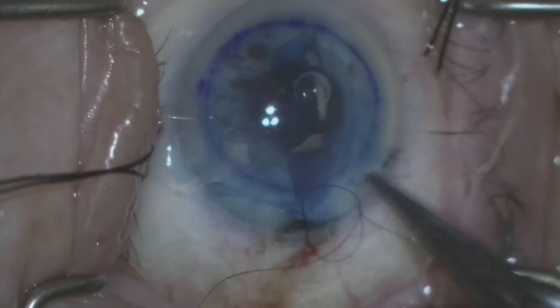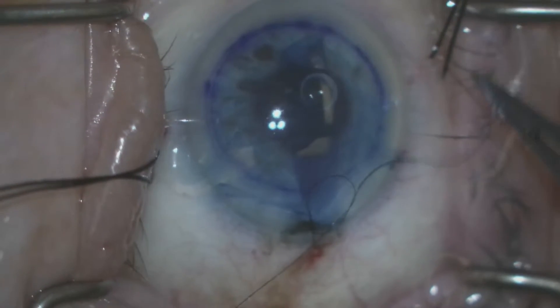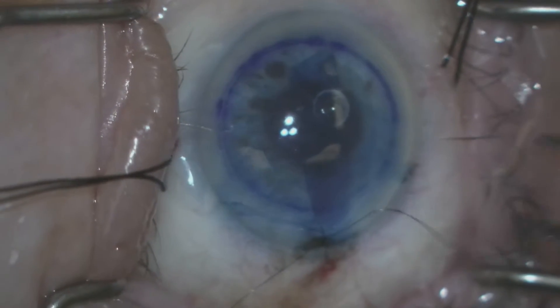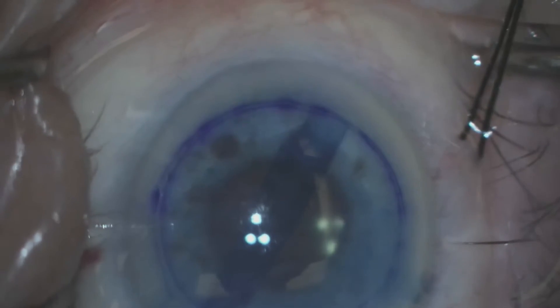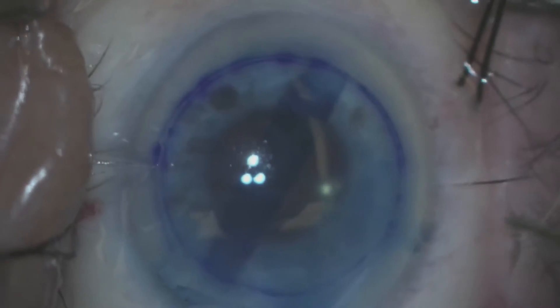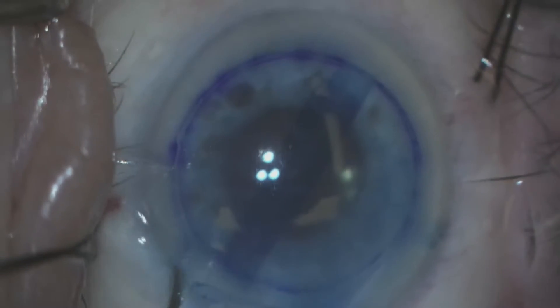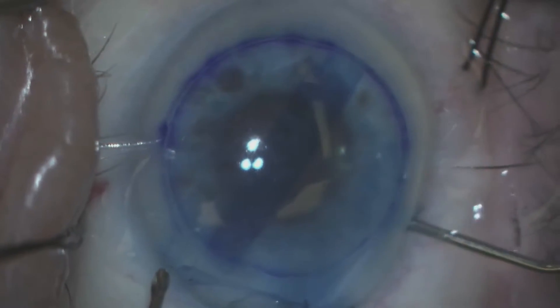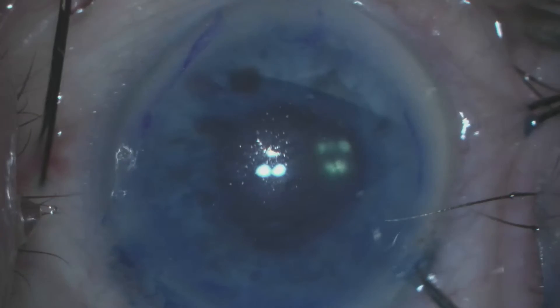We secure the scroll in the anterior chamber by securing our pre-placed nylon suture. The scroll is configured such that the endothelial cells are on the outer surface of the scroll and Descemet's membrane is on the inner surface of the scroll.